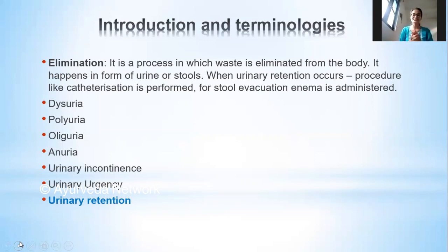In males, it's the standing position. Also, this is a very normal technique usually performed in children. If children are not passing urine, what do the grandmothers do? You just open a tap, and with the sound of water coming out of the tap, there is a psychological stimulation to pass out the urine. So that could also be done.